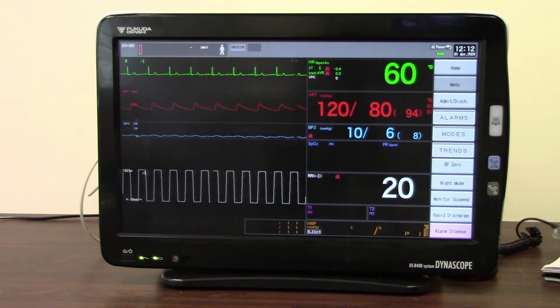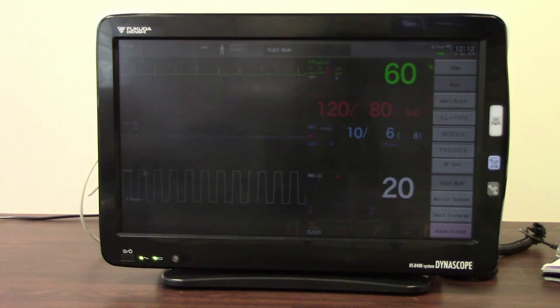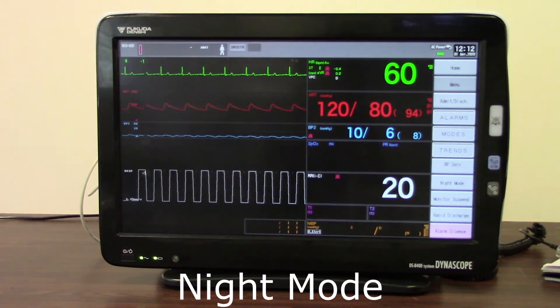Finally, we come to night mode. Night mode is available as a user key — if I press that it will darken my screen and quieten my alarms, so it's perfect at night time or patient rest times. If I want to take it back out of night mode, I just touch again.